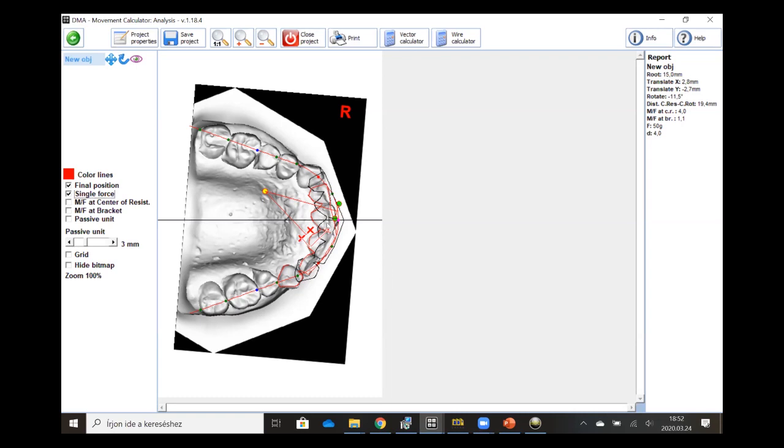You should attach it to the bracket of the right central or to an extension coming from it up. Okay, so how can we do? Of course, if you attach it to the bracket it is simpler, but as I said, we wouldn't like to have too much. We say that the force should be applied here or here.